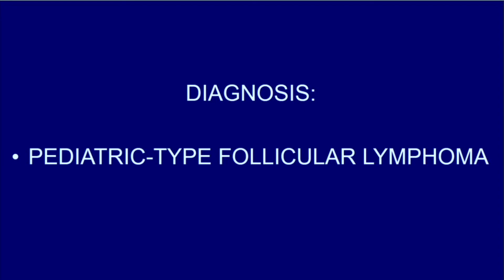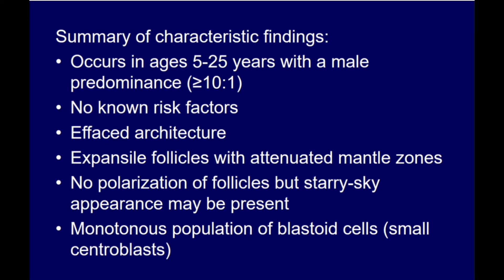This is a good example of pediatric type follicular lymphoma. The summary of findings includes effaced architecture with expansile follicles that have attenuated mantle zones, no polarization, and no tangible body macrophages. You sometimes do see a starry sky appearance, which can make people think there may be tangible body macrophages. There is often a monotonous small blastoid appearance to the cells, and even though the follicles are made up of small blastoid cells, this entity is not graded.